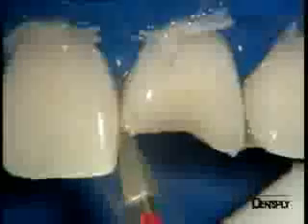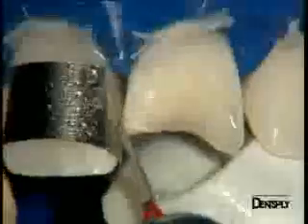A large labial bevel is then produced, continuing it proximally to ensure perfect continuity in terms of tightness of the restoration, in order to prevent any adverse colouring that may occur subsequently. The neighbouring tooth shall be protected while the proximal bevel is being made.